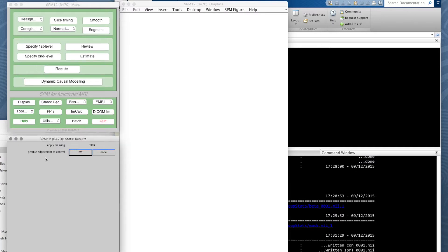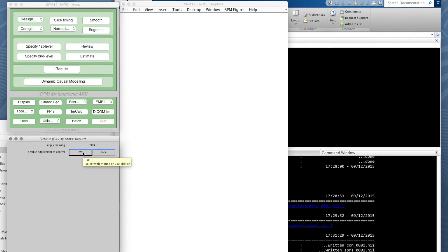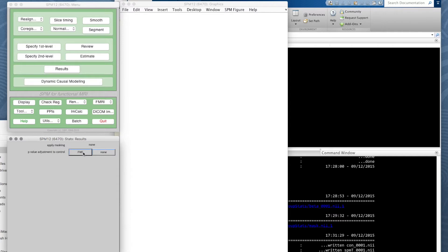Now it says p-value adjustment to control. We're going to use a standard 0.05 p level—that is to say, we only want to see those voxels which have a 95% confidence of a good model fit, and only a 5% chance of getting this with random data.